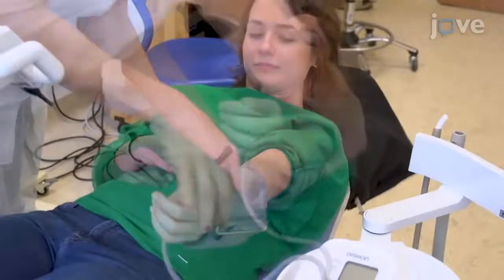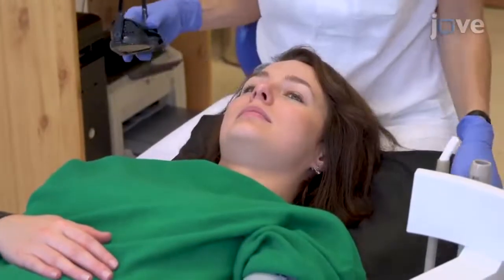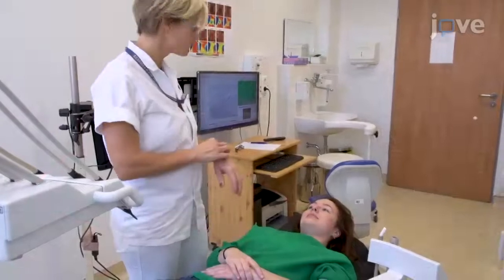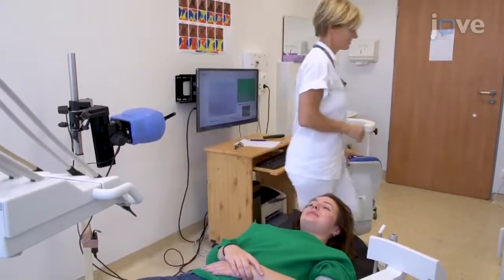Place a cuff around the patient's arm and a vacuum pillow under the patient's head. Then let the patient rest undisturbed for 15 minutes before any measurements are taken.